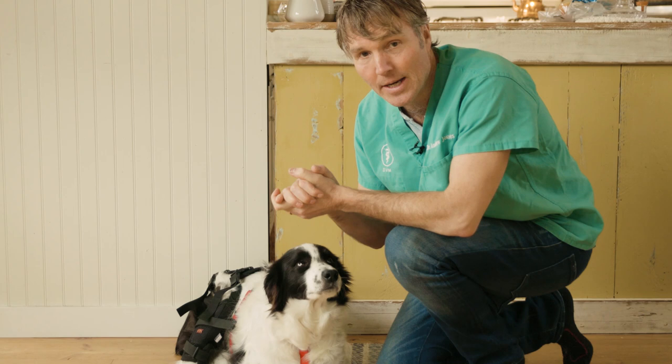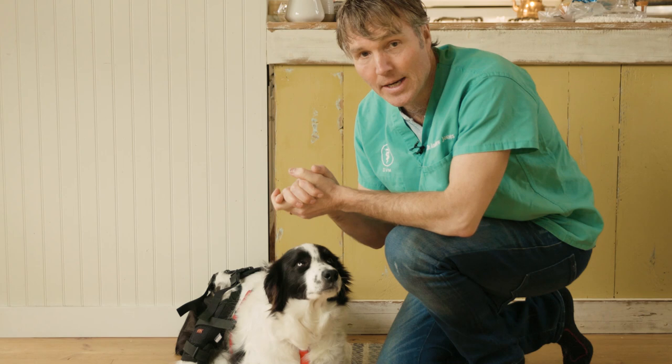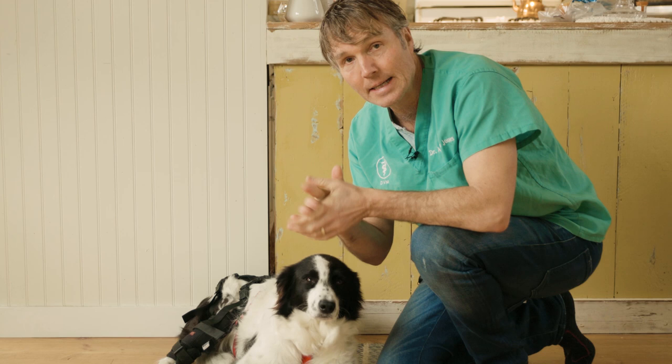I'm here visiting my brother on Vancouver Island. It just so happens he has a couple of border collies. This pup by the name of Heather has injured her right ACL. She's now fitted with a knee brace — it's been about a month. I wanted to show you what brace he's been using to help heal her knee injury without surgery.